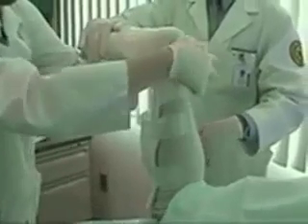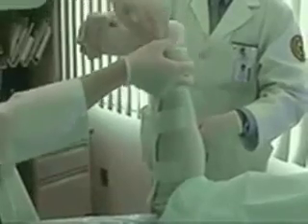You can see those wrinkles being rubbed out. Any tucking of casting material, either plaster or fiberglass, is done on the anterior aspect of the leg or foot at the site of padding. The application team is rubbing out any wrinkles, and what you have on the plantar aspect is a relatively pristine gypsona plaster applied.